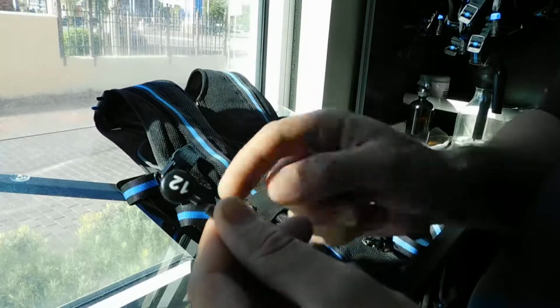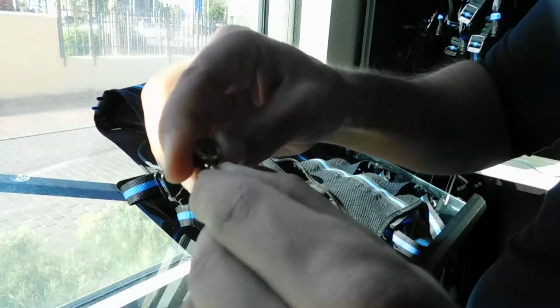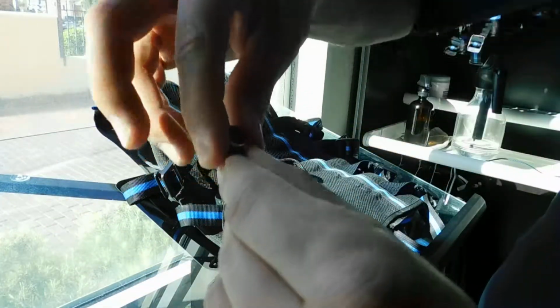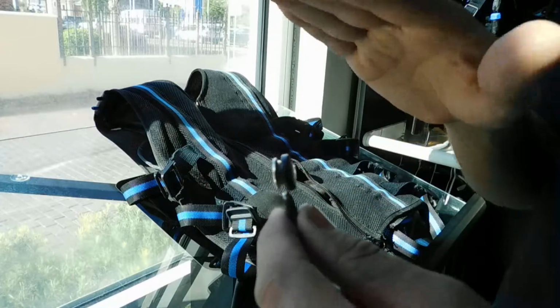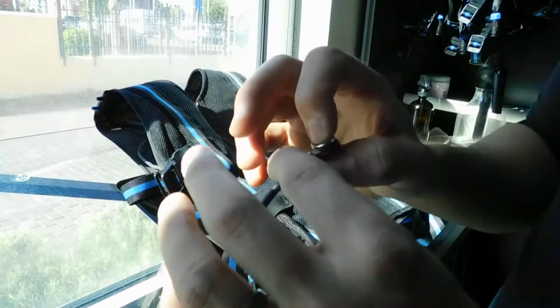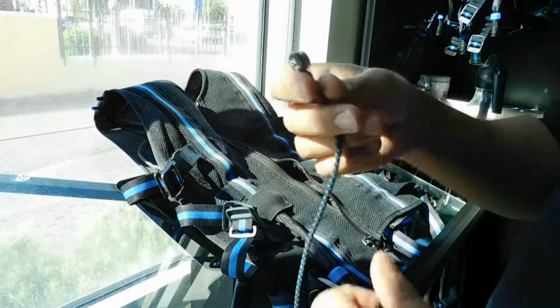If this right here, let's say this moves, this one doesn't move. See, I do this and it doesn't turn. So if this top actually turns like this, left, up and down, then it's loose. So if you turn it like this until it tightens, then it will be good again and it won't be wavy. So when you feel, let's say, chest press or abs, and it feels wavy like this when you do a crunch, more than likely it's either because this is coming off of the button of the electrode or because it's loose. So you just have to turn this until it tightens up, and then it should be good to go again, okay?